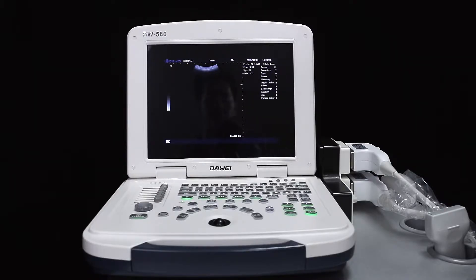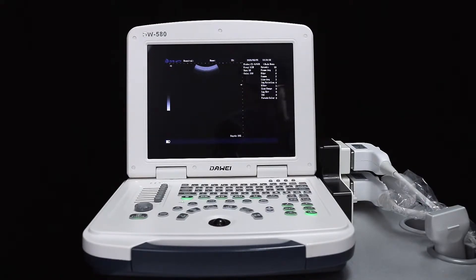This video covers how to create new patient information, measure steps, generate reports, and how to save pictures and playback videos.